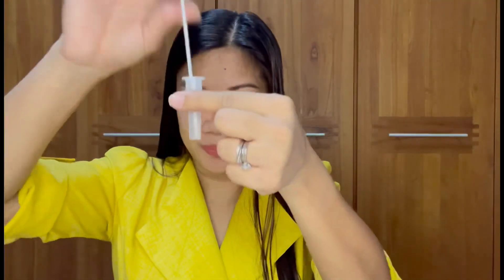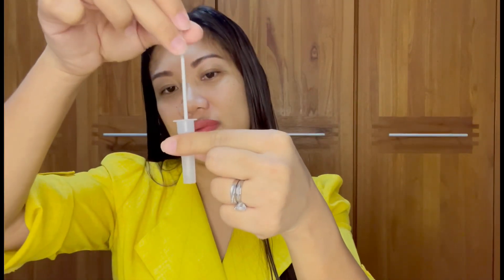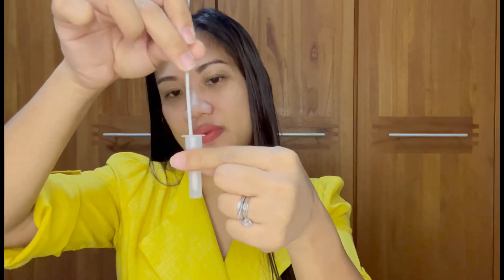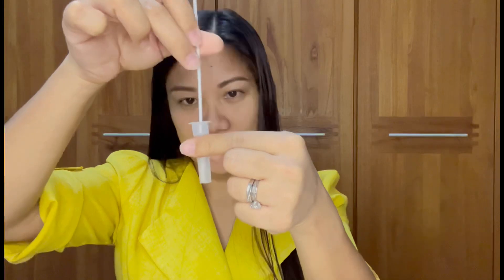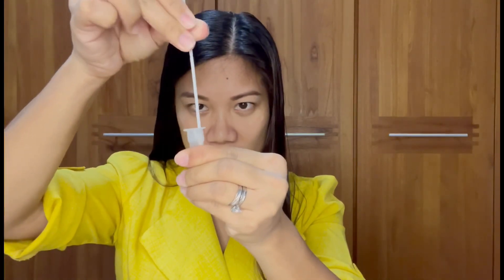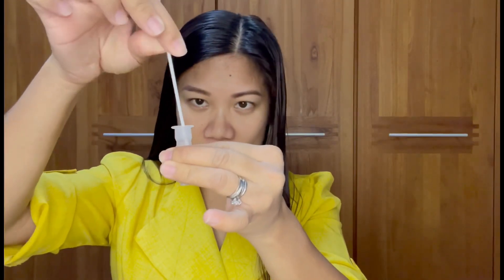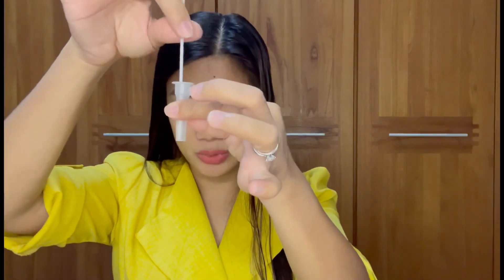Okay, so you have to open this and then use this one. You have to stir — 1, 2, 3, 4, 5, 6, 7, 8, 9, 10, 11, 12, 13, 14, 15, 16, 17, 19, 20. What I do is I always squeeze this one and do it again, to make sure.